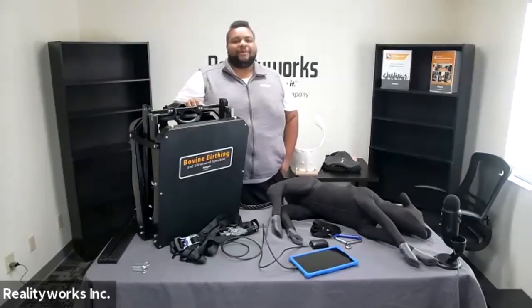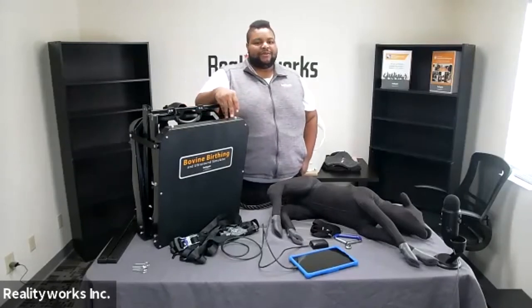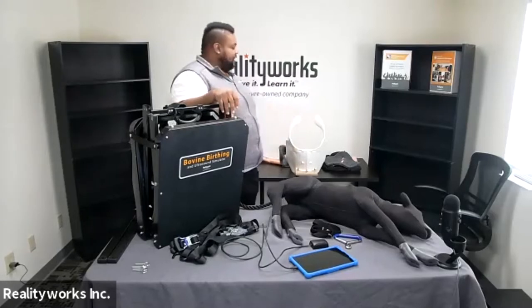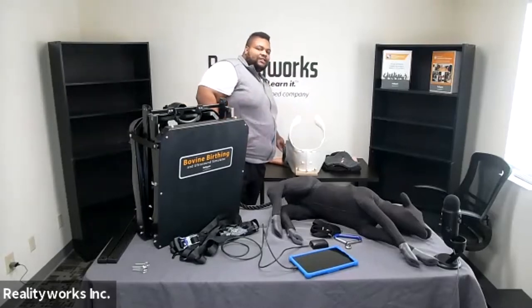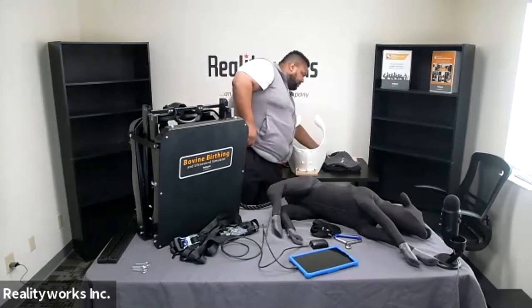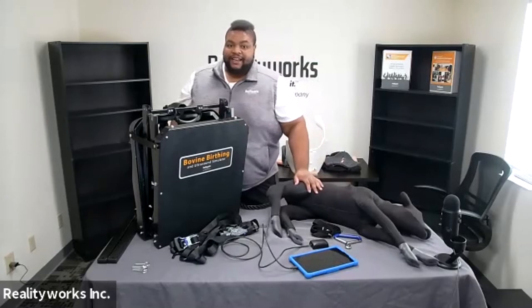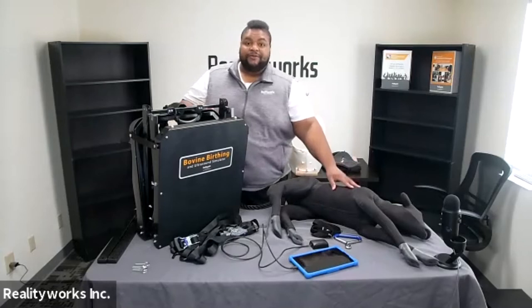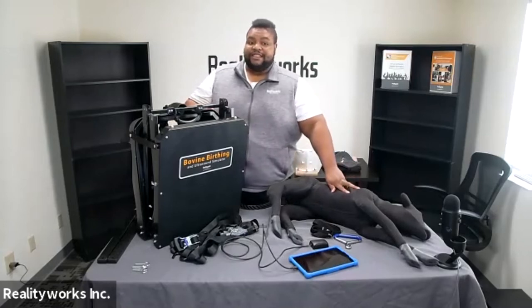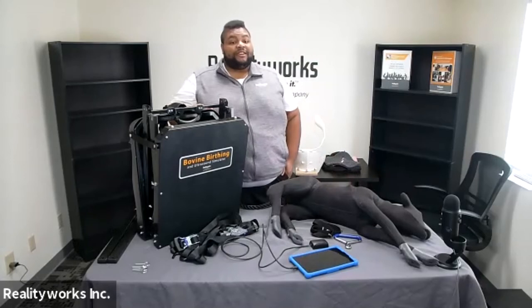So what comes with the bovine birthing and ultrasound simulator? You have the portable tabletop-sized birthing simulator, a removable ultrasound tray, and also the reproductive tract. You have the birthing calf model — it is lifelike, has the weight of a newborn calf, has joint-like movement at all extremities, and you can even feel the ribs inside the calf. The skin is made of neoprene, so it slides easily out of the birthing canal.